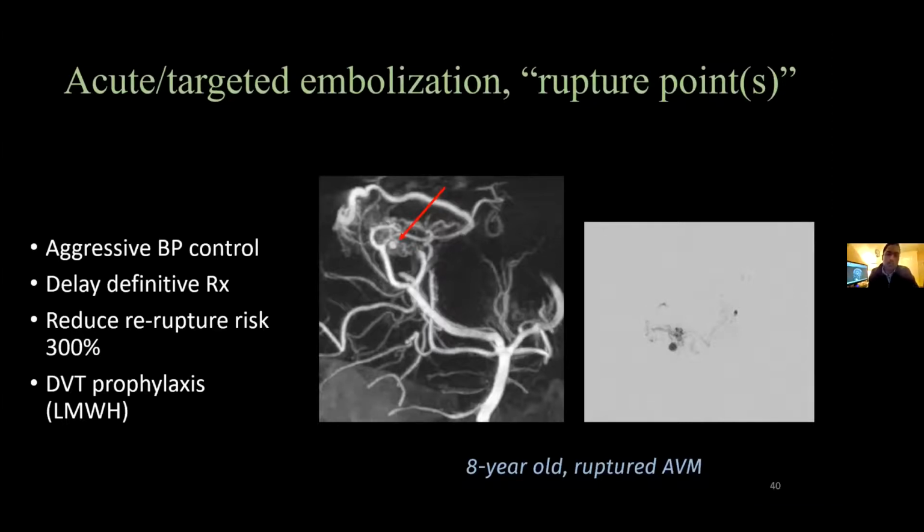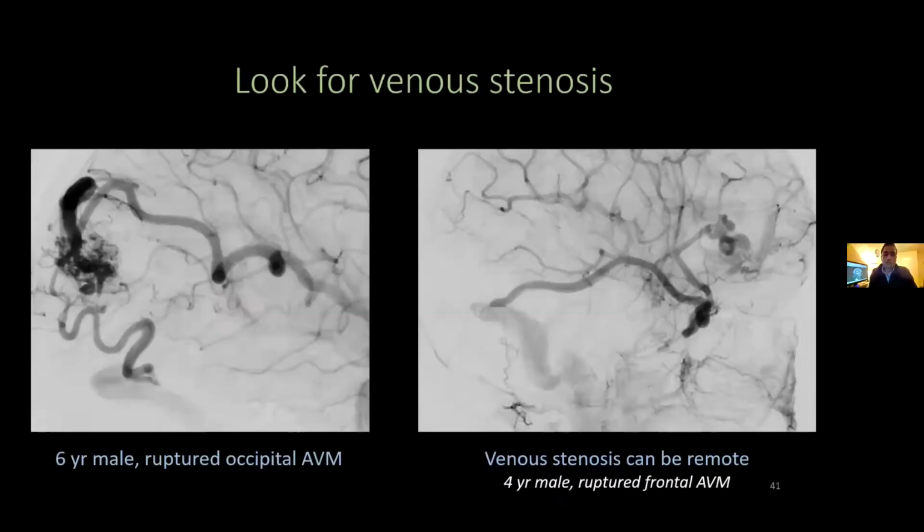So we are quite aggressive in trying to get into the nidus. Here you can see this is just a very focal closure of this nidus with glue, although we leave the rest of it and come back at a later time for a curative treatment.